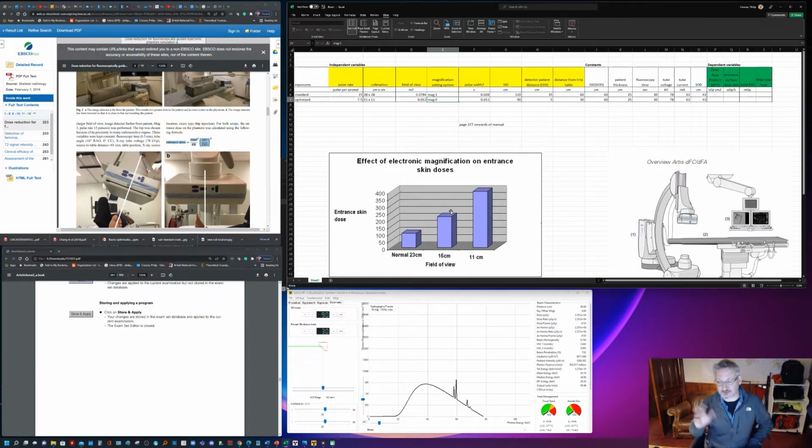I haven't got anything else to go on. I've looked at another paper or two and I know that that's about right. So I've come up with a pulse width of 0.028 seconds, or about 30 milliseconds, for the standard condition, and about 10 milliseconds for the optimized condition without the mag.